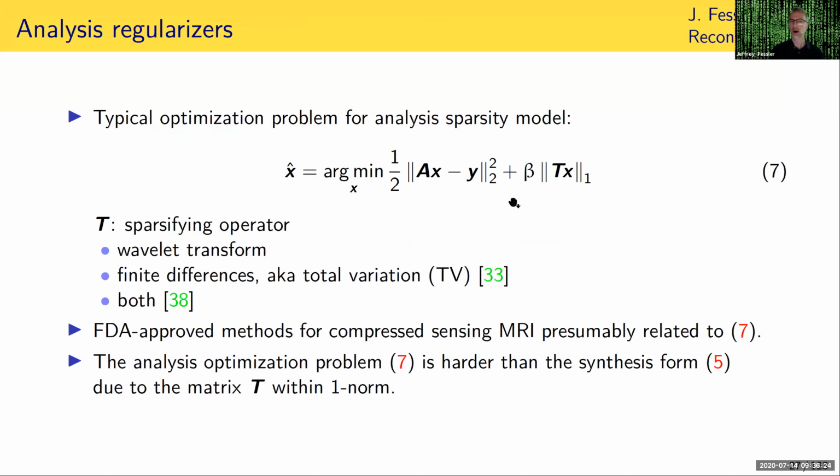In an analysis model, you don't have that same hard constraint. You put an analysis regularizer in, and you still have your data fit term as it is. So you're finding an image that trades off fit to the data and sparsity of some transform of the image. But you never require that your image lie in the span of any particular operator. So I feel like this might be a little bit more robust to having an imperfect choice of the operator here. And all choices are imperfect.